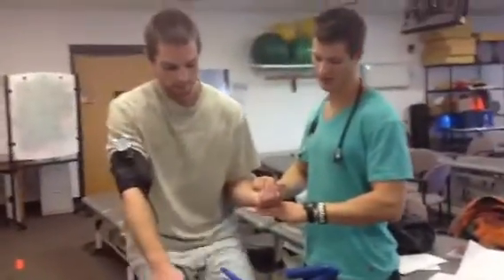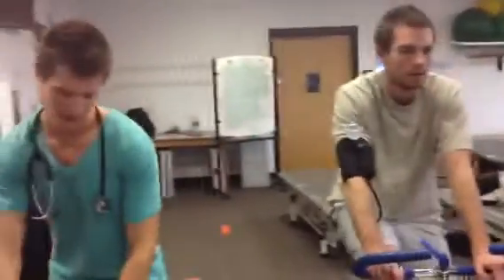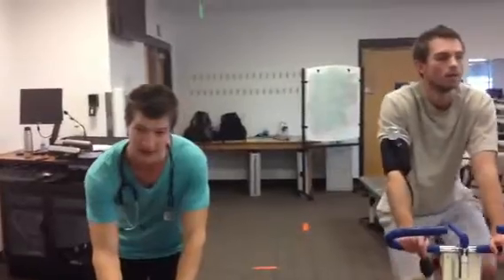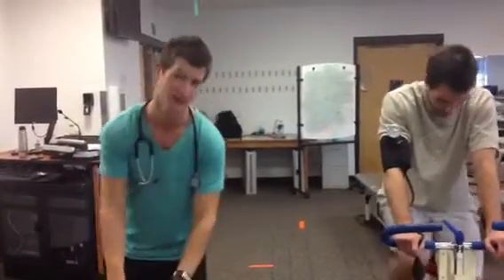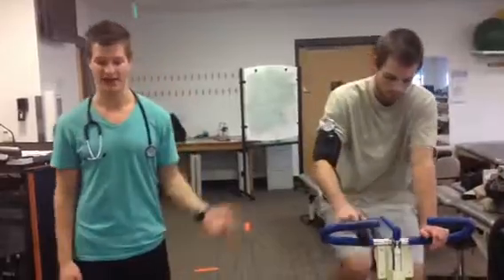Going to take heart rate again. Okay. And so he was a 14 on the RPE scale, and his heart rate climbed up a little bit. It went from 140 to 145. Still within about 5 beats per minute, and still in that submax range that we calculated earlier using heart rate reserve. So definitely what we're looking to see from a submax exercise test. We're going to repeat those values at the last minute of the Astrand cycle test, and then we're going to terminate hopefully.